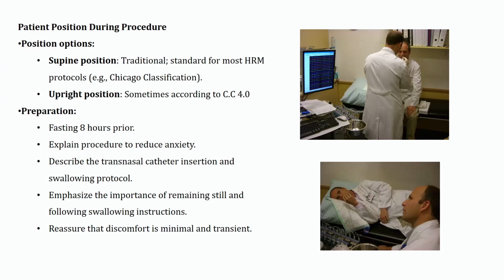He has to fast for at least 8 hours. We have to explain the procedure to the patient. I think we mentioned this last time, but it's very important again to explain to the patient what the procedure is, and also how we are going to insert the catheters from the nose to the stomach, and what he is going to feel during the insertion.